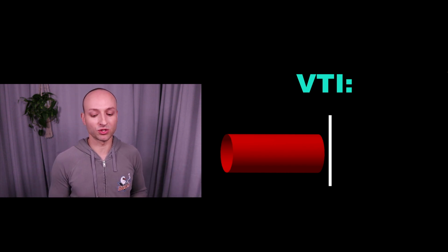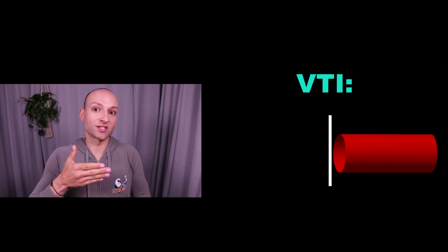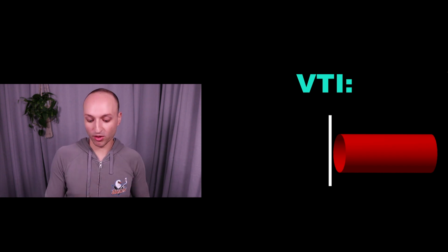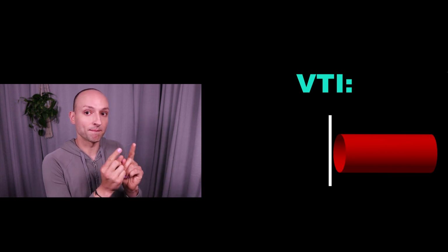What you're really doing is trying to measure the amount of blood that goes through a certain area over a heartbeat, over a period of time, right? Most commonly we think about this as far as the LVOT outflow, and how much blood is actually going through that LVOT. There are a lot of different calculations you can do. You can take this VTI, the diameter of the LVOT, and the heart rate, and calculate cardiac output. So this is just a component.